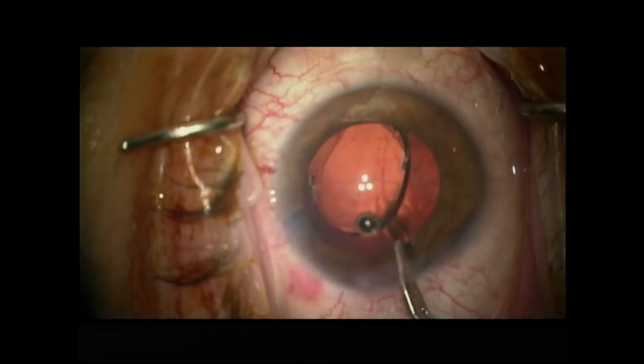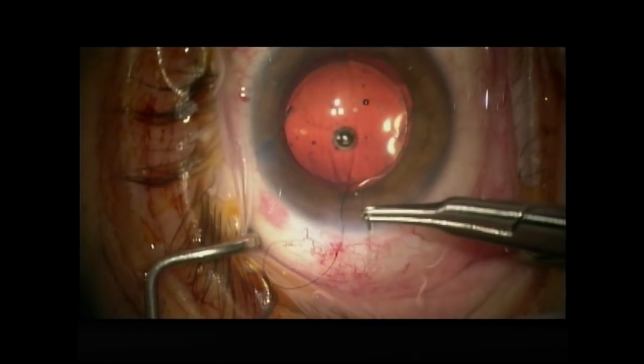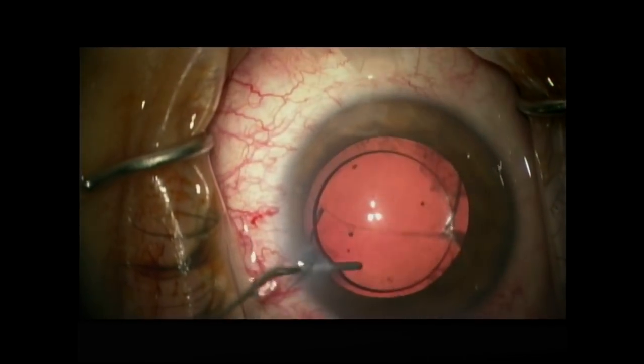When the cortical material had been completely removed, a 3-piece lens was then placed in the sulcus and optic capture was achieved. The incisions were sutured shut and were noted to be watertight.